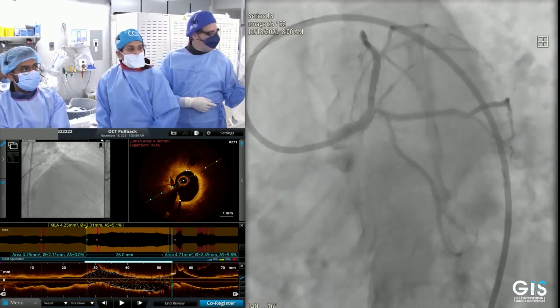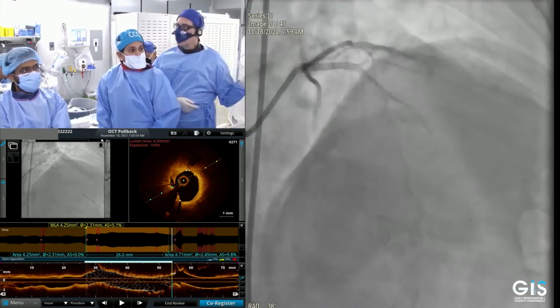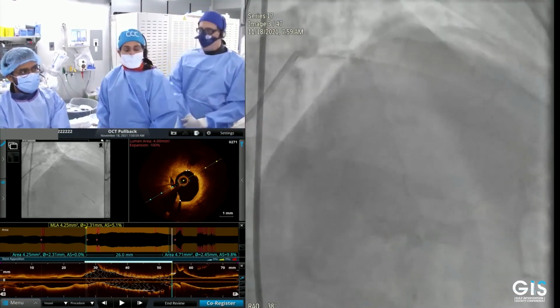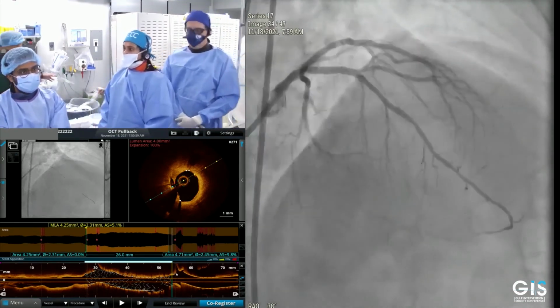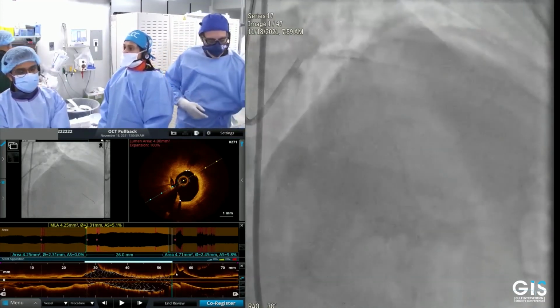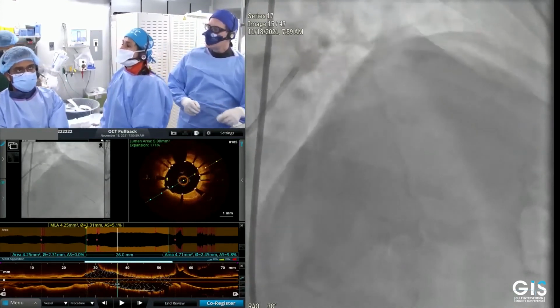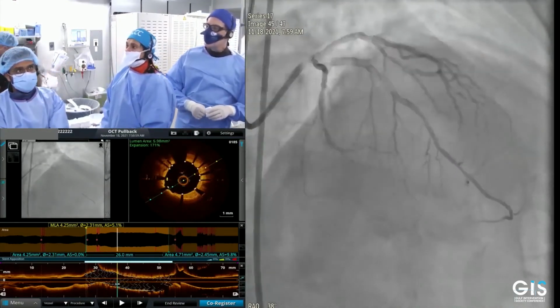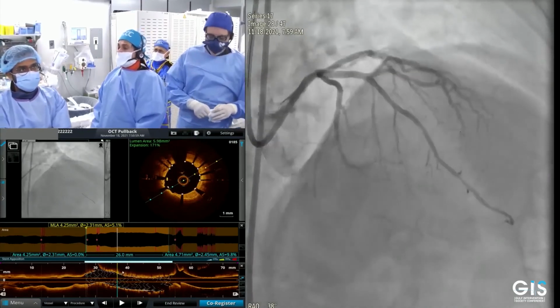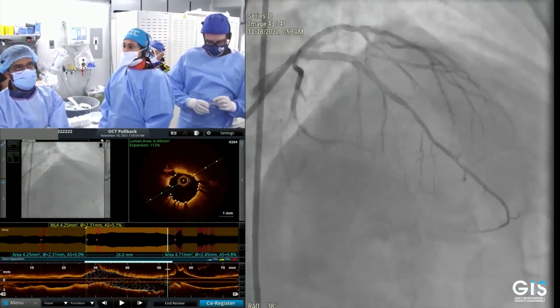I'm replaying them again. This is a completion angiogram. So imaging, great, saved you a POT. Can you ask the audience? Definitely imaging saved us a POT. Yeah. Question, Dr. Davis, what's the MLA or MSA here? MSA, they're going to give us a minimum stent area by OCT. About 6 plus. It is over 6. How about the proximal part or the ostium? So beautiful.